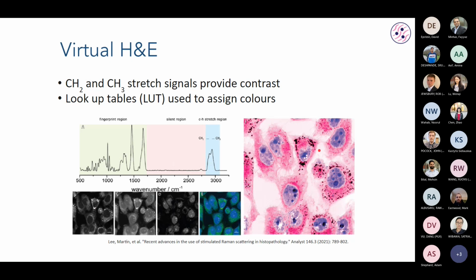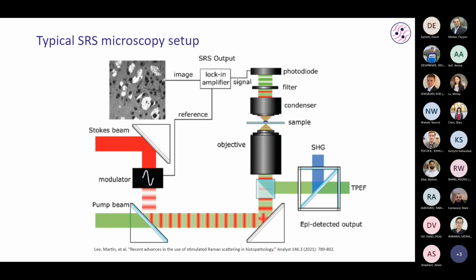So does this not use any kind of optical objective in the microscope setup? So they have a couple of lasers, and there are lenses involved to focus and things like that. Sure. Do we know if the resolution of the images obtained with this setup is higher than conventional microscopy?